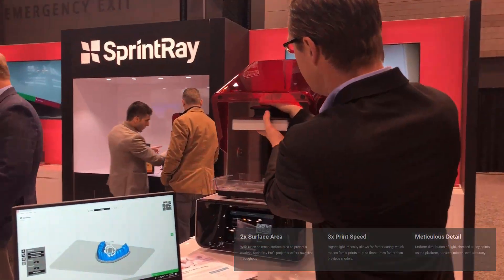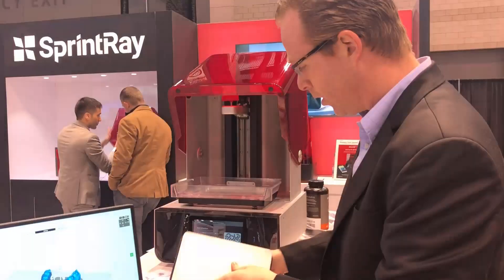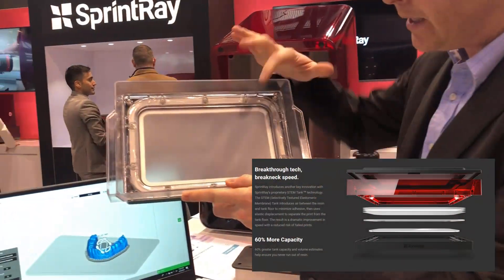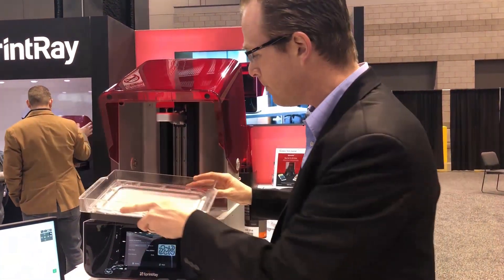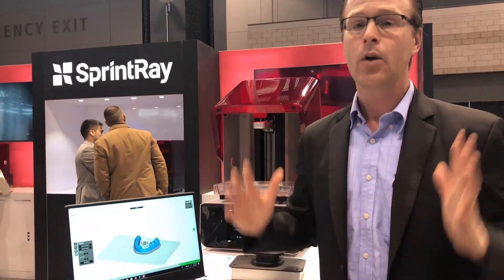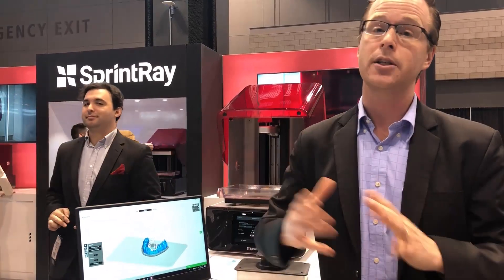So you can see here, it's just really big. Huge. This resin tray pops out, and you can see how big this resin tray is. Inside, a completely sealed chamber, so very minimal risk of any of the components and materials getting inside the chamber. It's a complete revolution in terms of the Moonray 3D printing — now the Sprintray Pro.